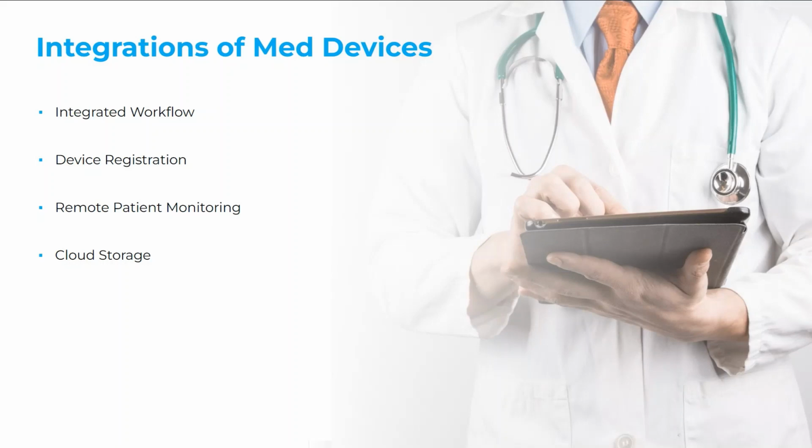That may be theoretical, because in the real world we have a lot of different issues that could get in the way of this integration. There's a lot of different software standards, interoperability standards that we've talked about in a previous webinar as well. But this integrated workflow, where the medical device isn't off by itself doing its own thing and you have to figure out how to incorporate that data into your patient care, is obviously ideal.